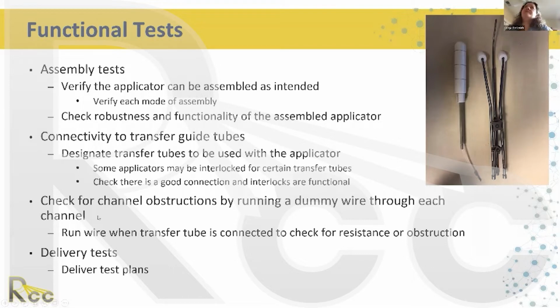What happened to me once is that a physician broke a couple of applicators because he wasn't clear about one point of the assembly and put too much load on a part of the applicator. So if you assemble this before the applicators get sterilized and practice this with your team, everybody knows how to do it correctly. You should check the connectivity to transfer guide tubes.